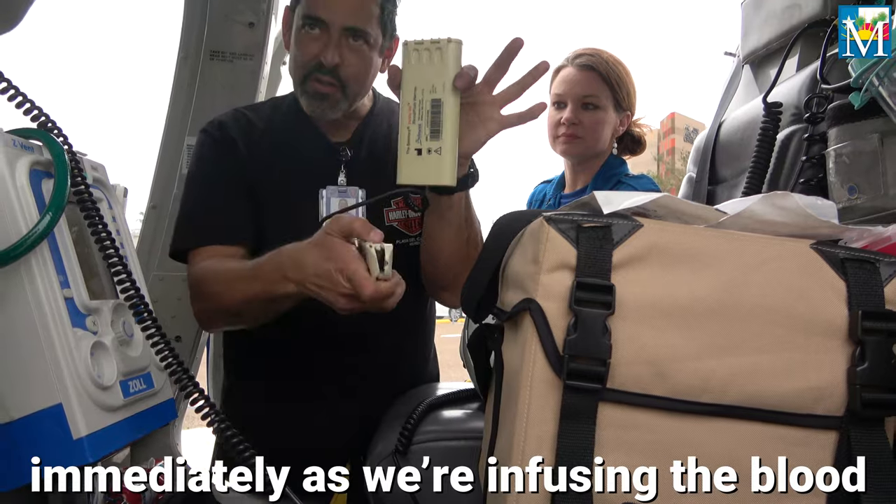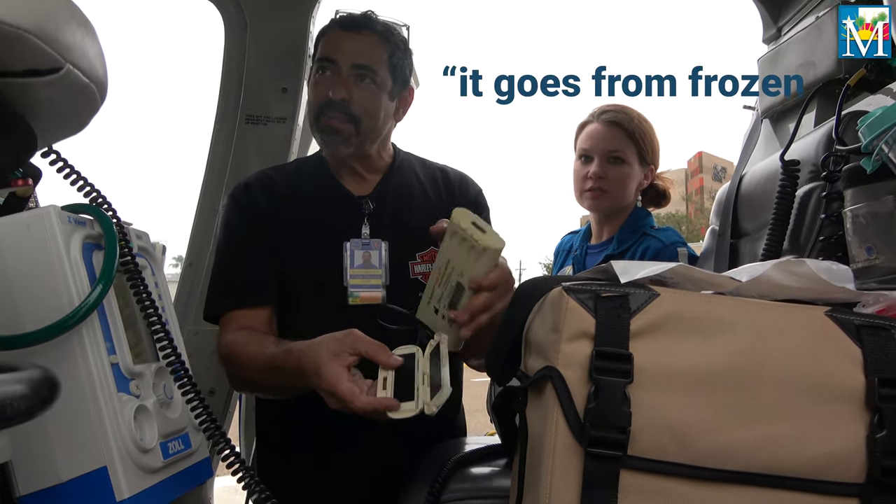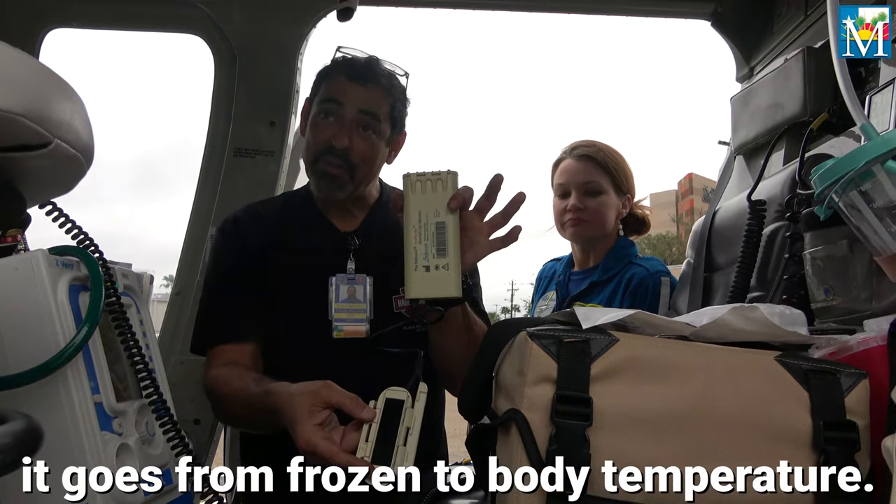Immediately as we're infusing the blood, it goes from frozen to body temperature.